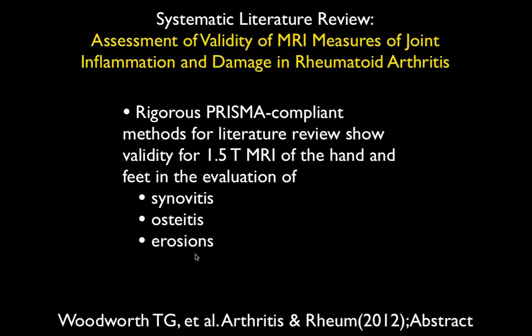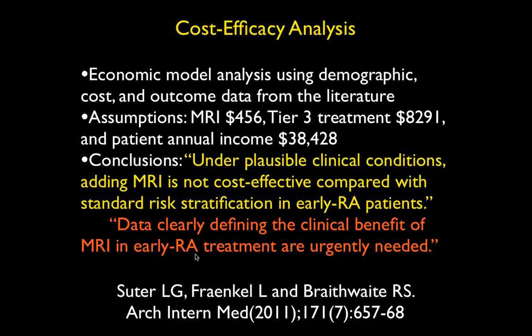And the next thing they're going to do is look at lower field strengths to see if they can also show that it's validated at lower field strengths. And then there was one cost efficacy analysis in Archives of Internal Medicine, where they claimed that the cost efficacy analysis shows that there's not a clear benefit from MR.